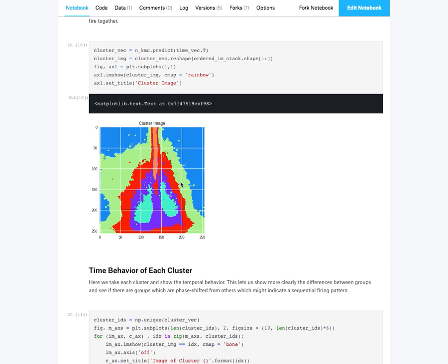So if the input was the time series, the distance metric was just a Euclidean distance. What does it mean that these 2 points are bright blue and not purple? It should mean that they follow similar time curves. Exactly. It doesn't mean they're next to each other, it simply means the time series are similar.